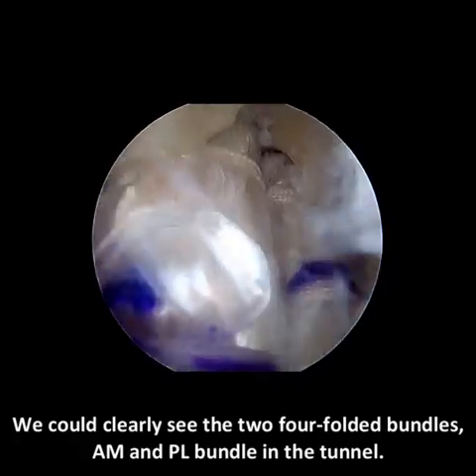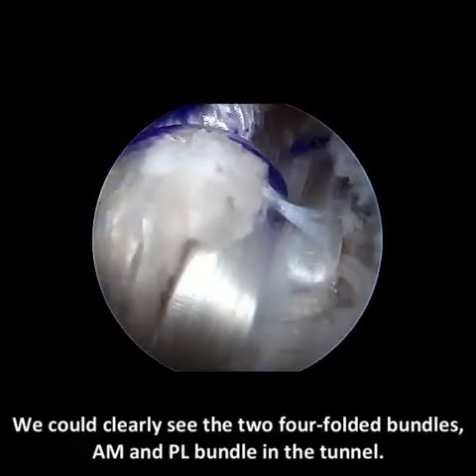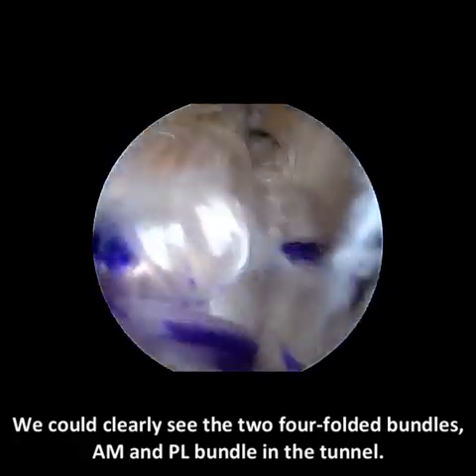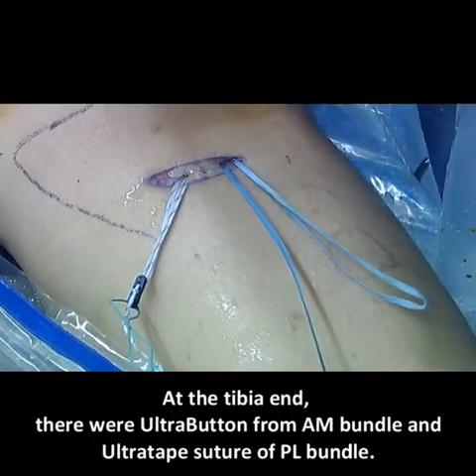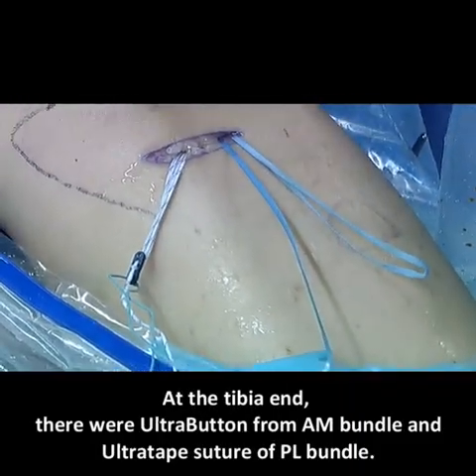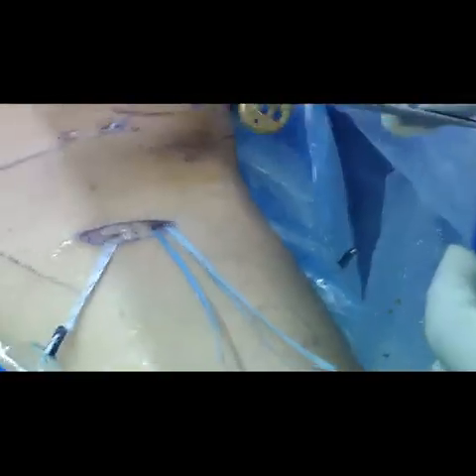We could clearly see the two four-folded bundles, AM and PL, in the tunnel. We started graft fixation. At the tibia end, there was the ultrabutton from the AM bundle and the ultratop suture of the PL bundle.